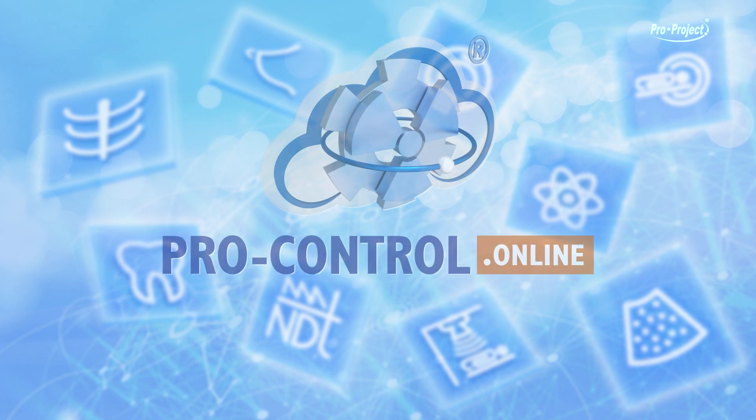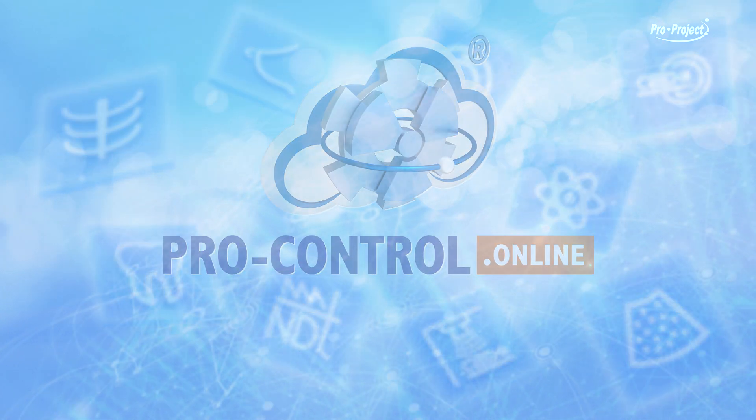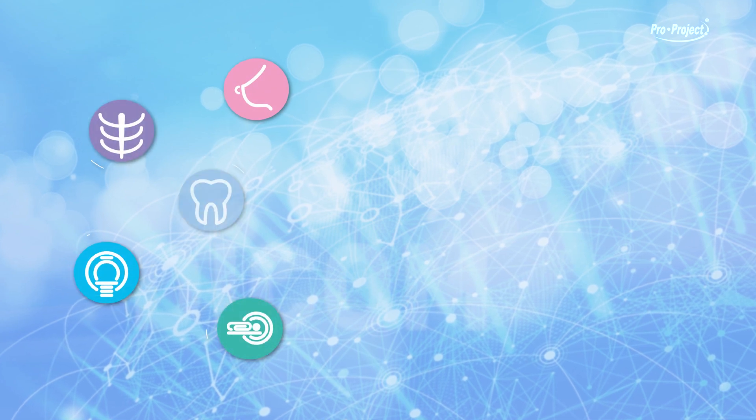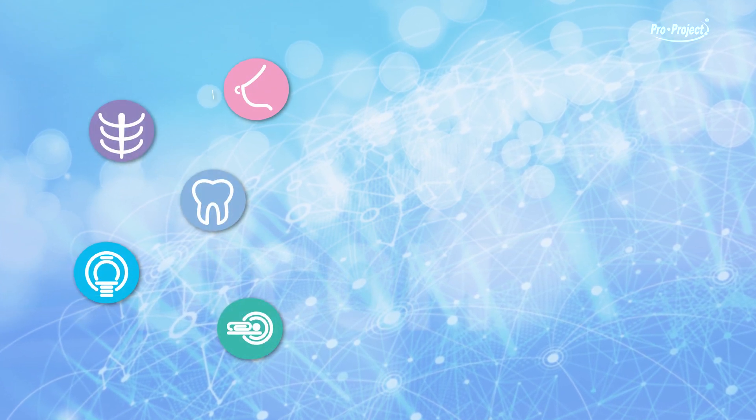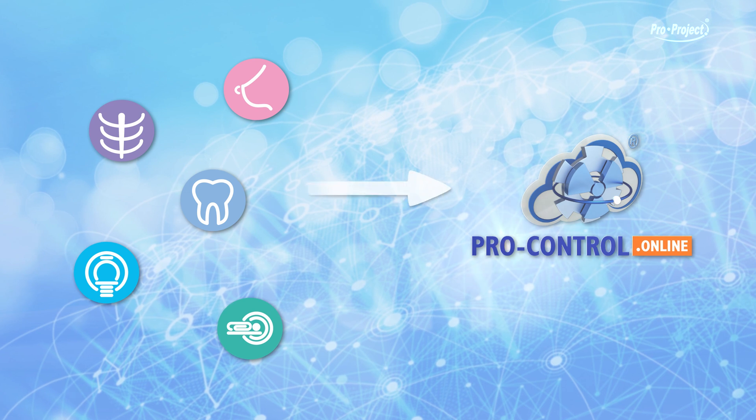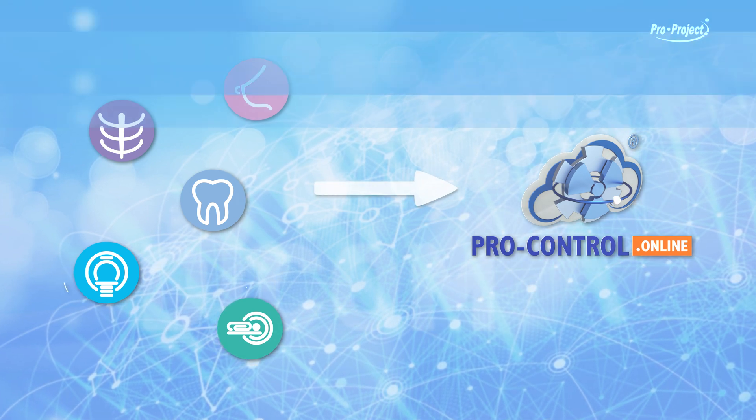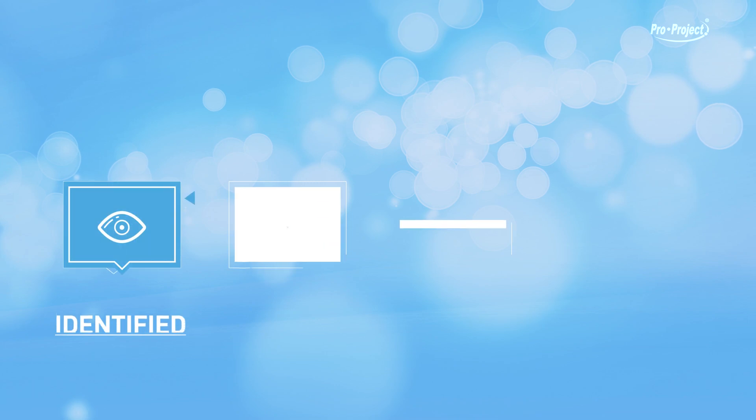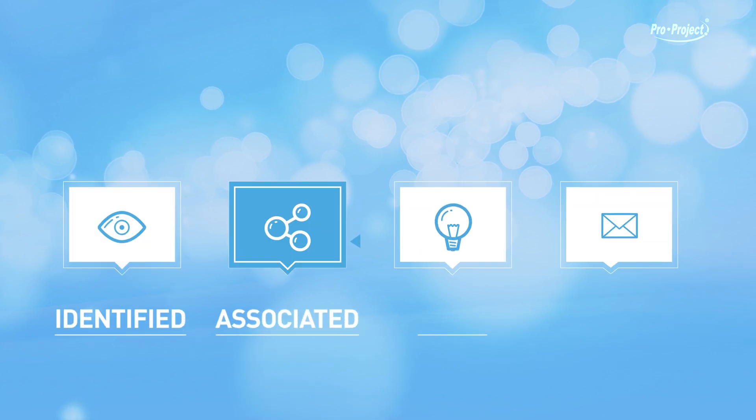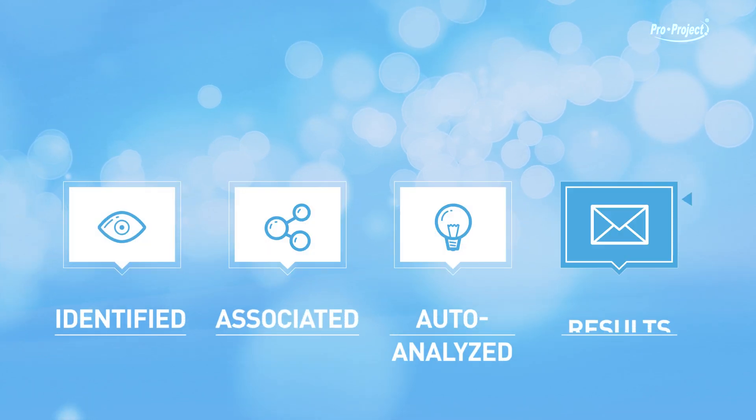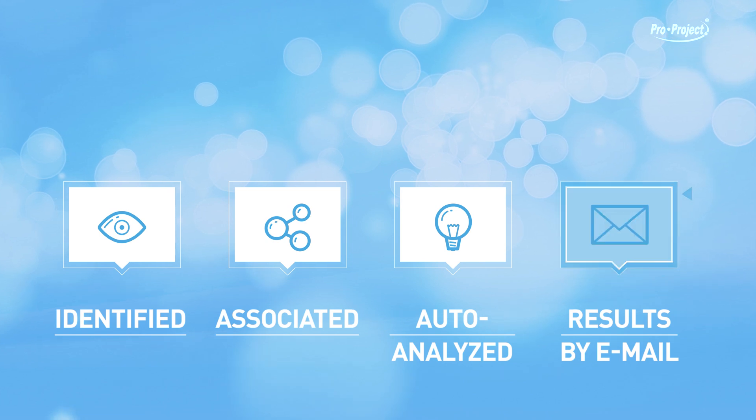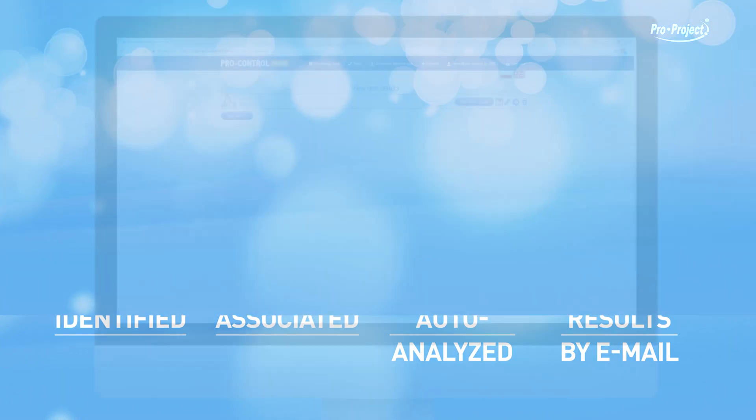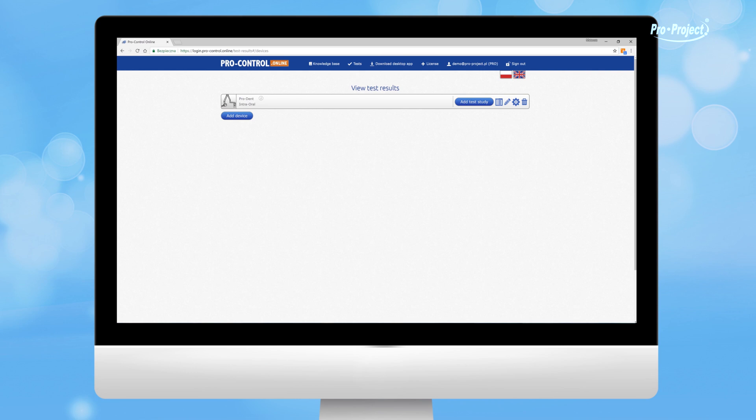Send all acquired images to ProControl Online. You have several options. Use full automation and send DICOM images directly from the device to your ProControl.online account. While there, images will be automatically identified, associated and auto-analyzed. You will receive an email about the results of the evaluation and if all tests are passed, you won't even have to open the app.